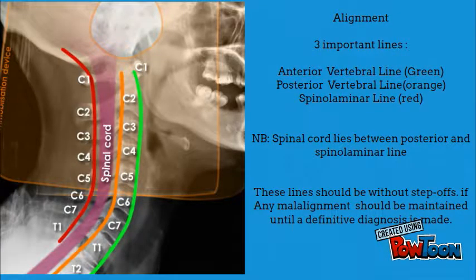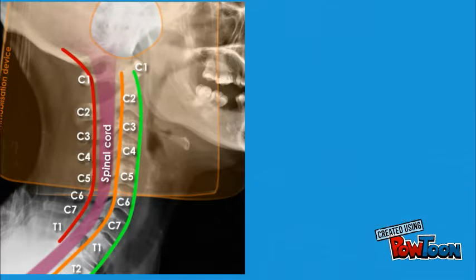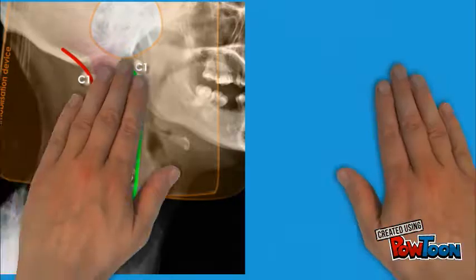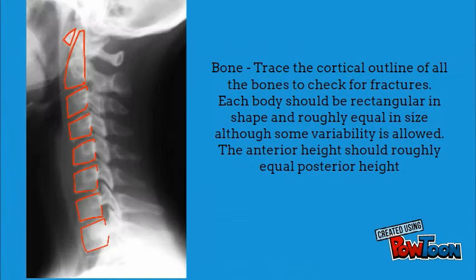Inspect the anterior vertebral line in green, the posterior vertebral line in orange, and the spinal laminar line in red. Note that the spinal cord lies between the posterior vertebral and the spinal laminar lines. Trace the cortical outline of all the bones to check for fractures.